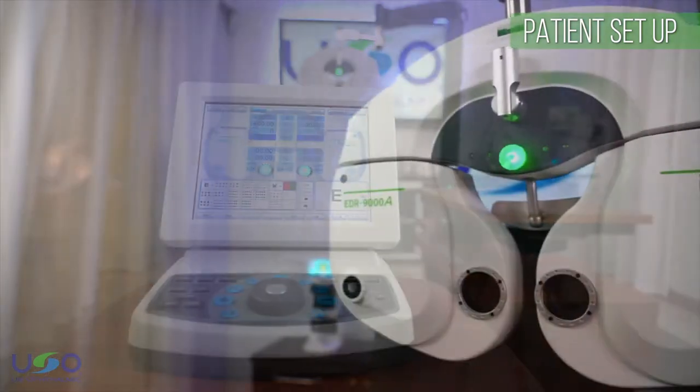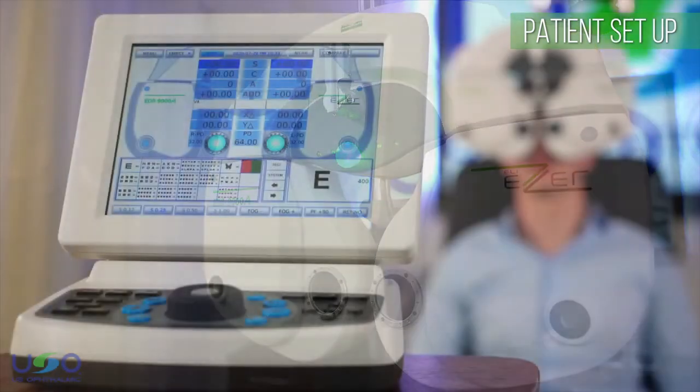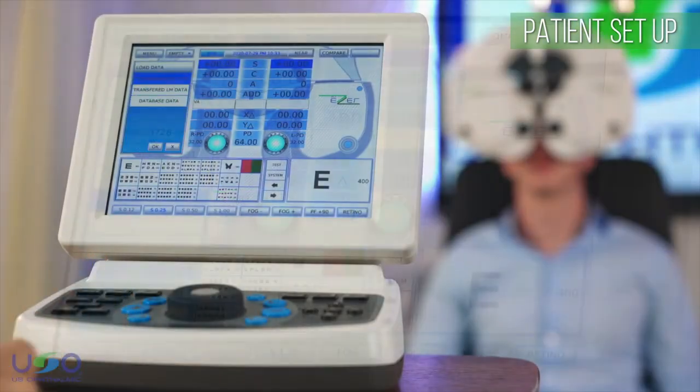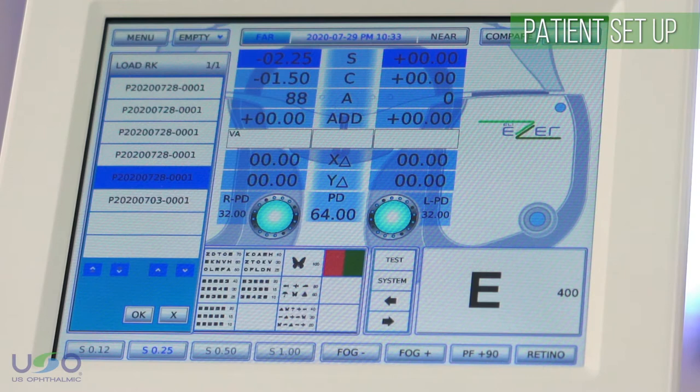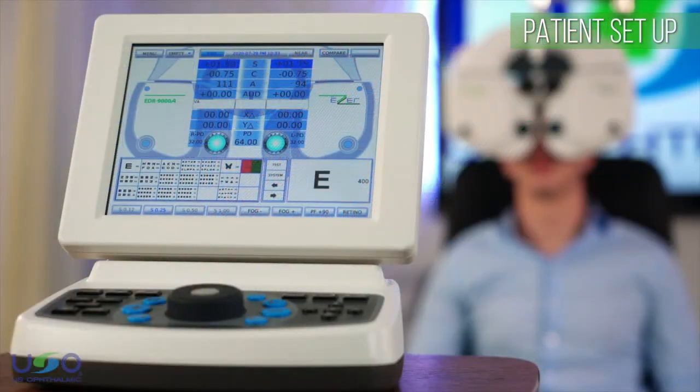The next step is to mount the objective refraction onto the head of the digital refractor. This is done by pressing the load key, selecting RK, and choosing your patient's number. In this way, all the data provided by the autorefractor will be automatically loaded, including the inner pupillary distance.